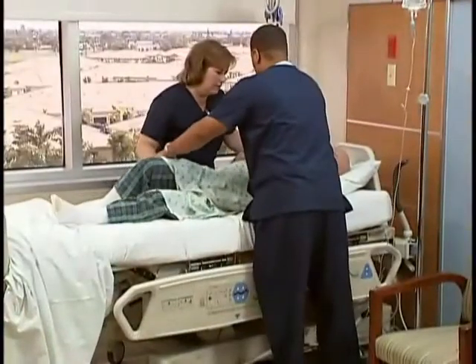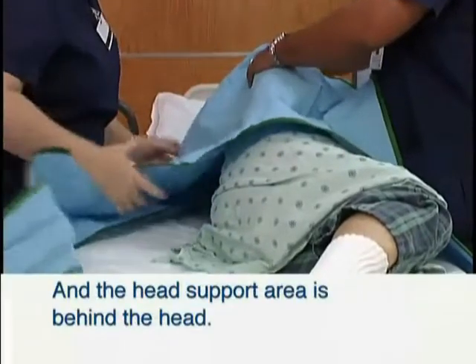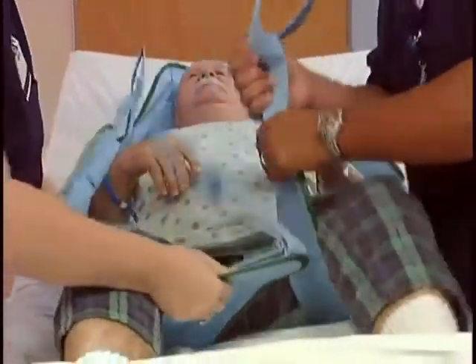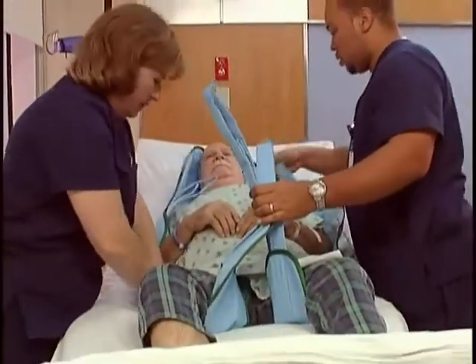Place the sling around the patient so that the base of the patient's spine is covered and the head support area of the sling is behind the head. Pull each leg strap under the thigh so that it emerges on the inside of the thigh. This can be done with the log roll technique or when the bed is in a seated position.